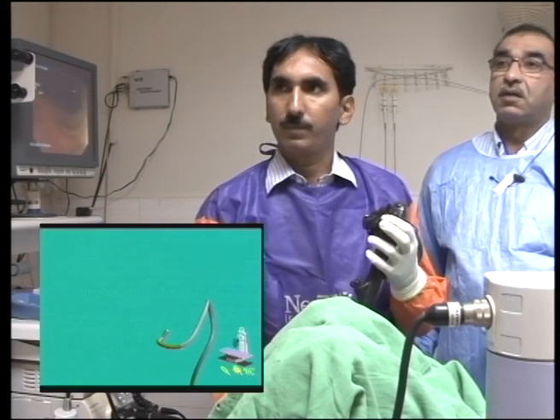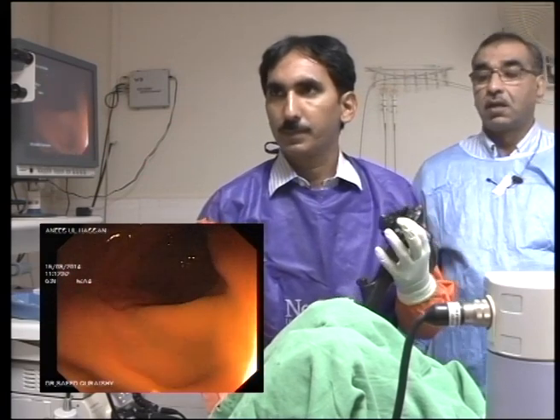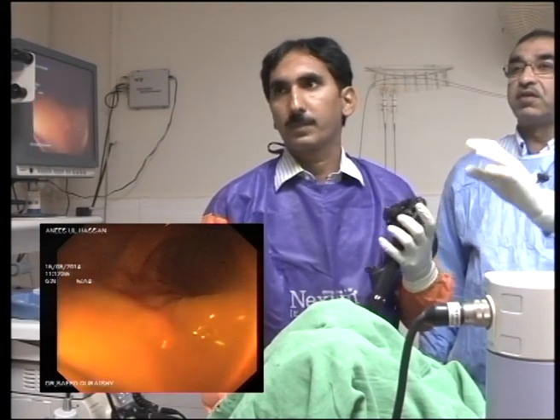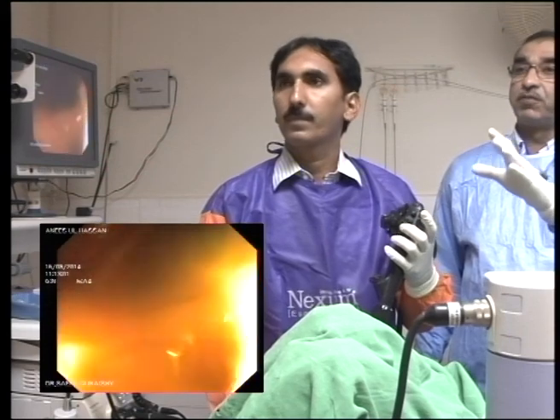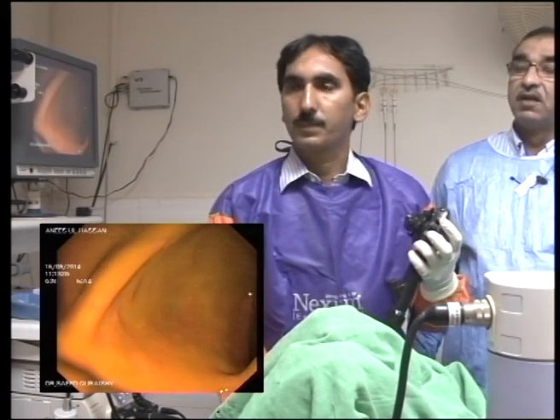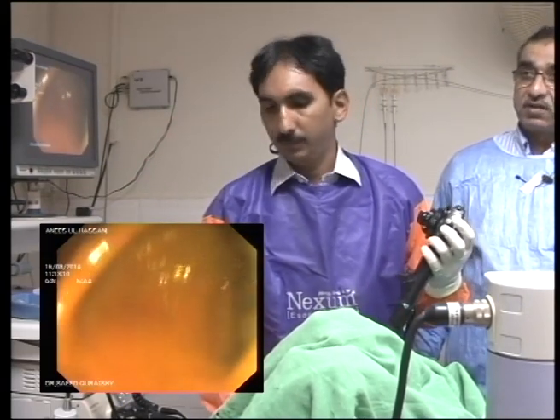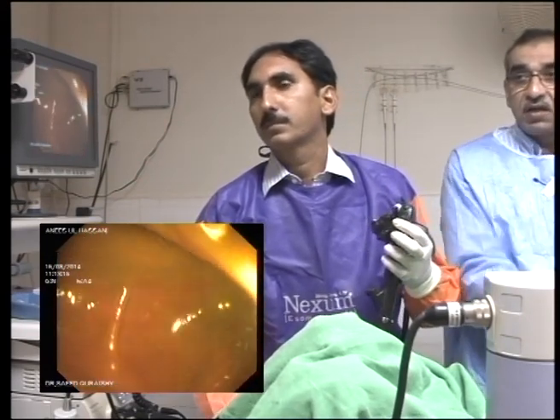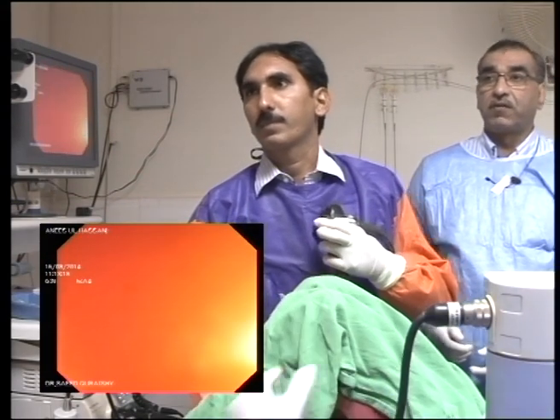Clear your lens. Yeah, keep going. Don't suck. The steady state, don't change it if it's causing no problem. So don't suck or blow air unnecessarily. If it is stable like that, you don't have to do anything. Advance a little, keep looking at it and advance. Give it a slightly clockwise torque, and here we'll use a bit of a wash.